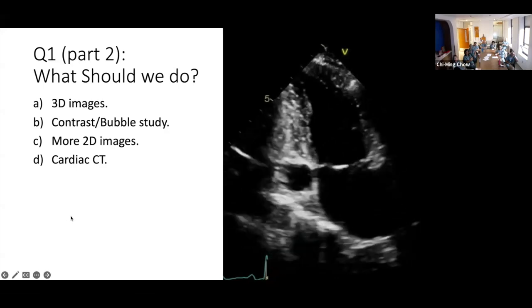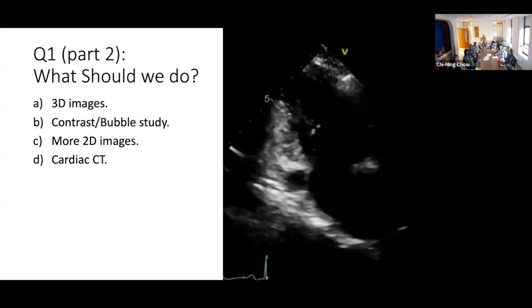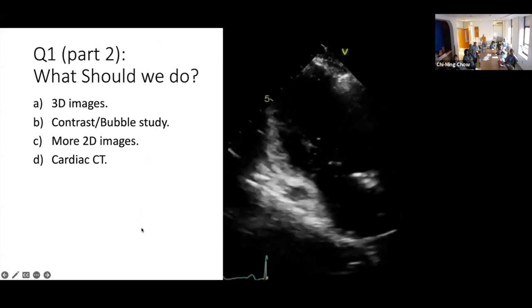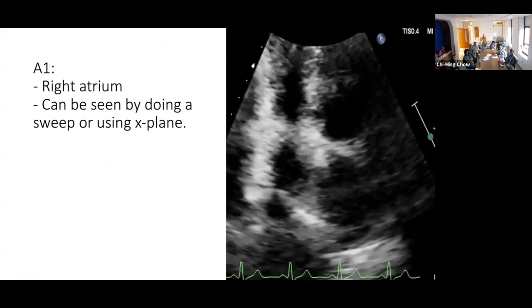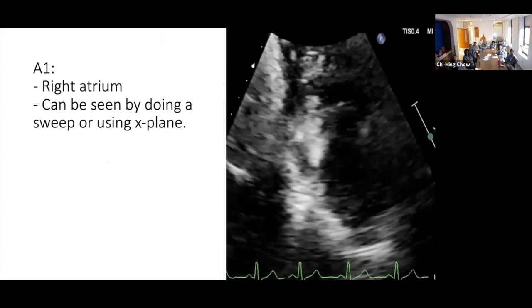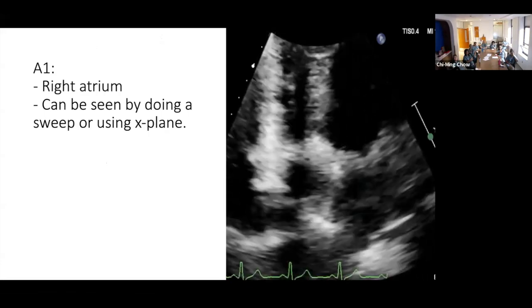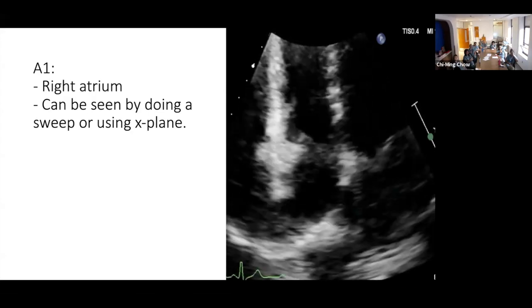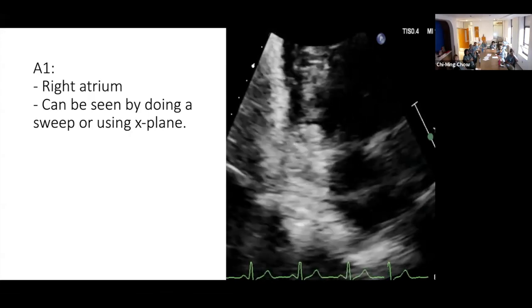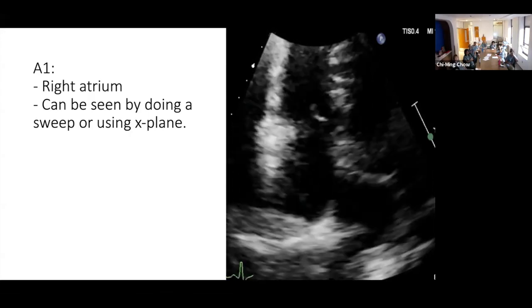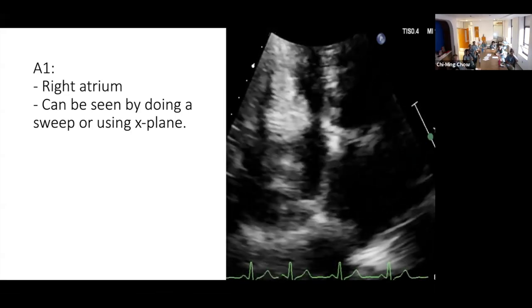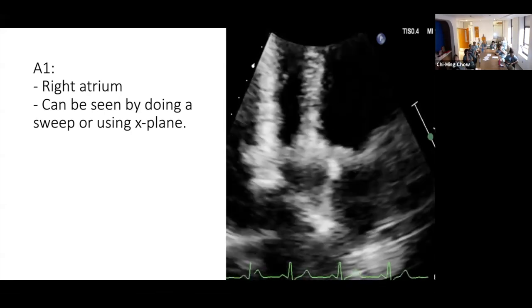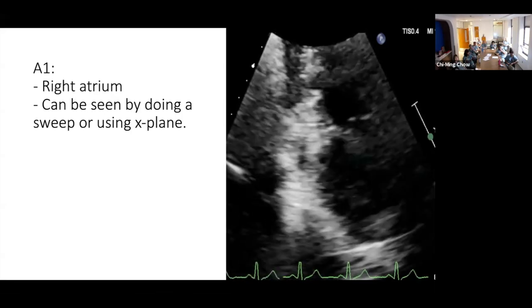She took the probe and did a sweep from the apical 4-chamber all the way to the apical 2-chamber. It turned out to be just the dilated right atrium sitting there, because it is not the usual place for the coronary sinus. The coronary artery would not be this large and compressible. You can also use an X-plane and show it at 90 degrees. I remember one of my seniors used to say: you should be proud of your modality. You should not send the patient for another modality unless you did your best with what you have.